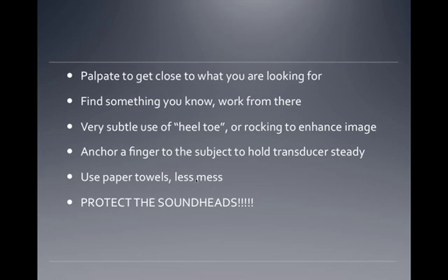We're going to be using paper towels to clean up our gel mess. You'll find real quick if you're using a regular towel that the gel just kind of sits in that towel, and you'll end up putting your hand or something else in it. So use a paper towel. That way you can just wipe and throw away as the paper towels become soiled. So you're going to want a big stack of paper towels where you're working, and a trash can.